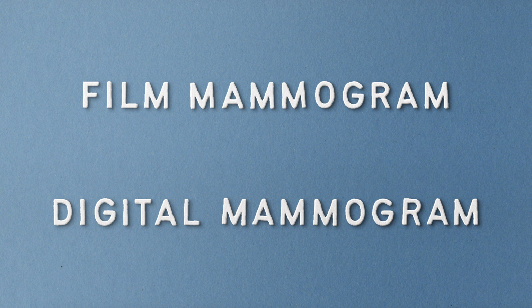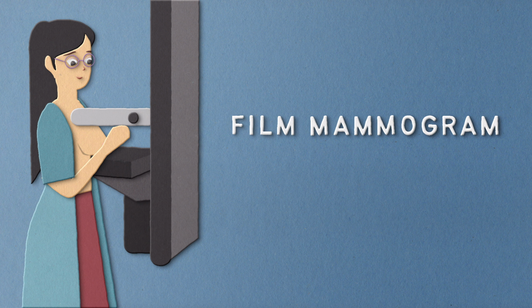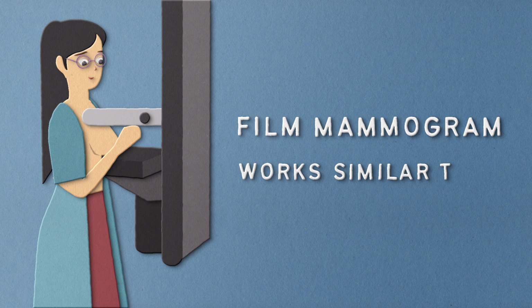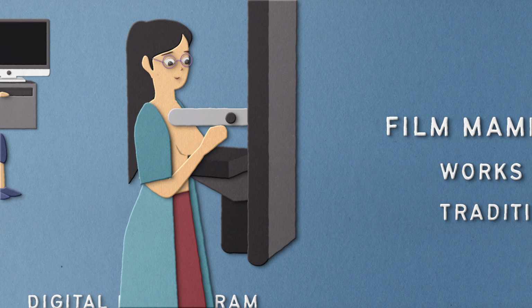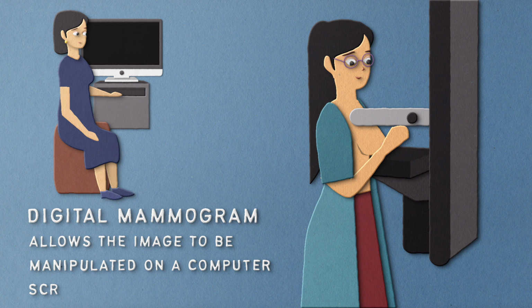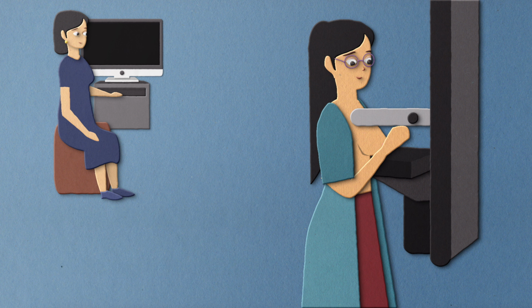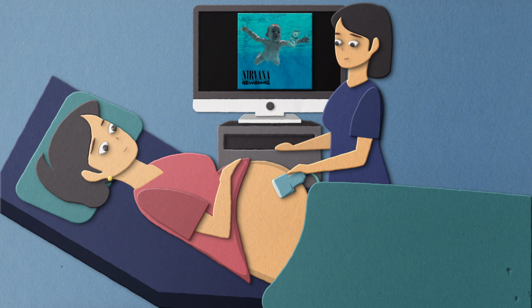There are two types of mammograms: film and digital. Film mammograms are the traditional method and work a similar way that a traditional X-ray on your bone would. Digital mammograms allow the image to be manipulated on a computer screen and are generally considered more accurate. A lot of screening centers now use digital mammograms. And that's it for the list of the major types of medical imaging.